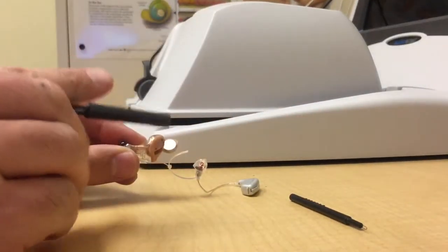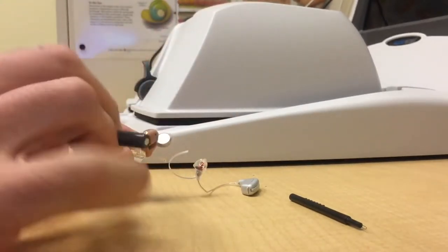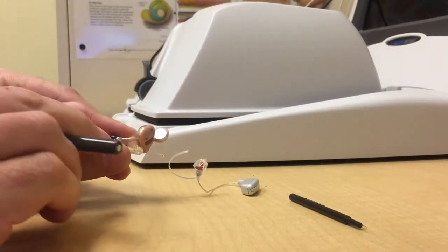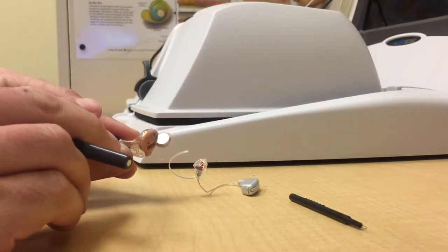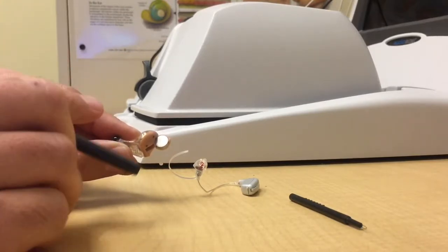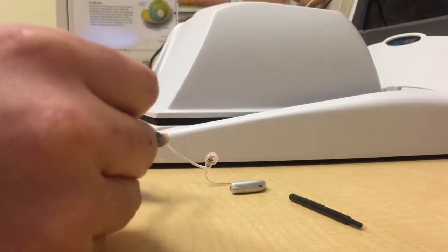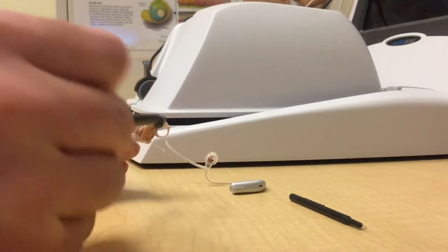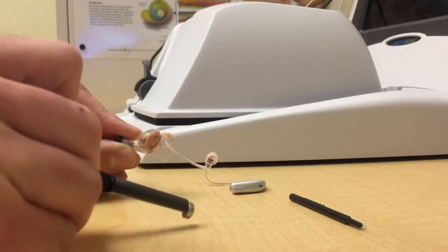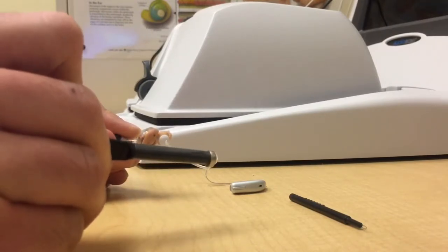This is essentially a stick that you can hold onto nice and tight, gives you good leverage. At the end of it is a strong magnet that allows you to pick up anything metallic, like a battery. So to remove this battery from this hearing aid, I can just put the magnet right on top there and then pull up, and the battery will come right out.